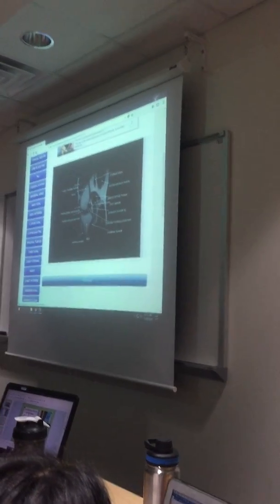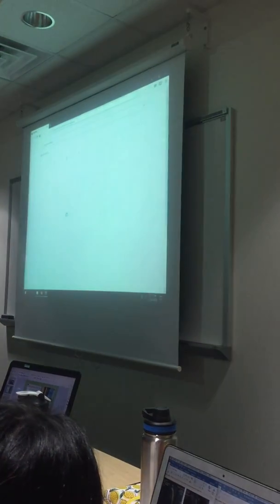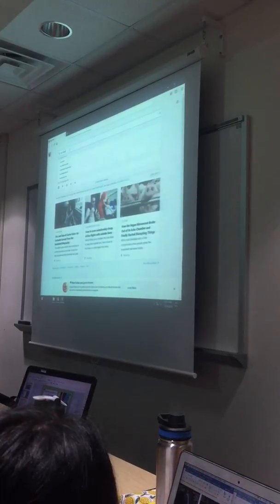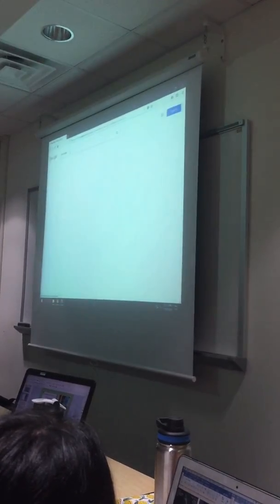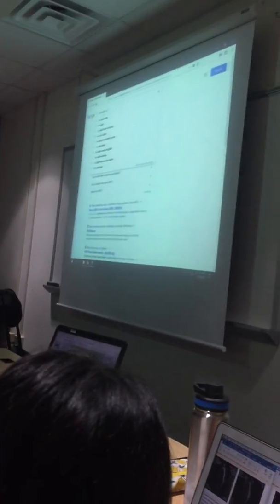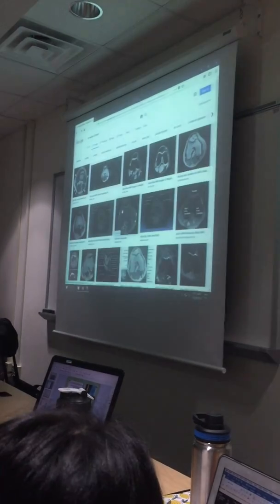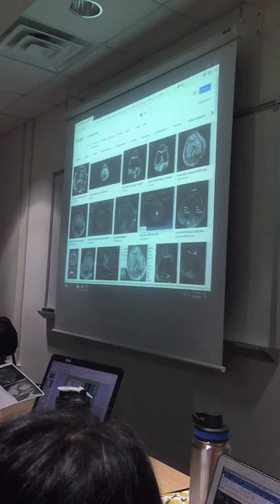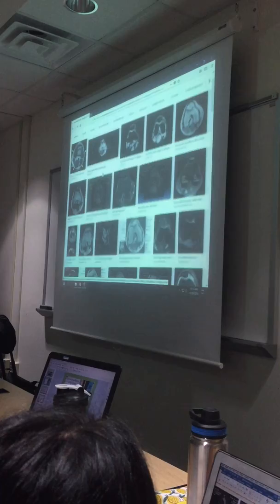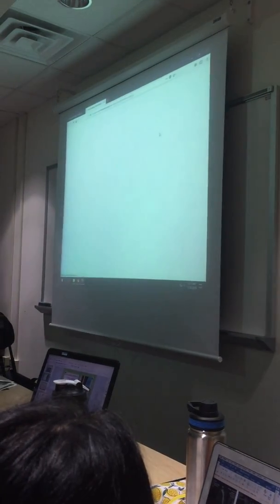Let me pull up an axial of the knee, because the very first series, our pulse sequence plane that we are going to scan, are going to be axials. So once I'm looking, trying to find a good picture here. This would be a perfect picture.